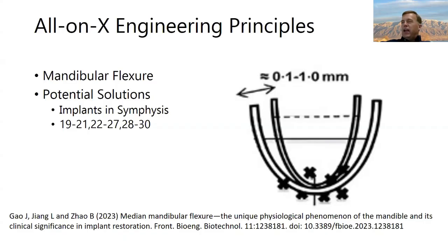One of the things that can be interesting is if you deliberately do an FP1 style case and break it up so that you're doing 3-unit bridges, say, or 2-unit bridges, as case may be, behind the foramen, and then you're putting another bridge in the anterior. So you're deliberately creating a space. If you do a splinted restoration that goes across the foramina, you can potentially cause stress shielding, and then your bone and your prosthetic and your implants are all fighting against each other, which may not give you the awesome result you want.